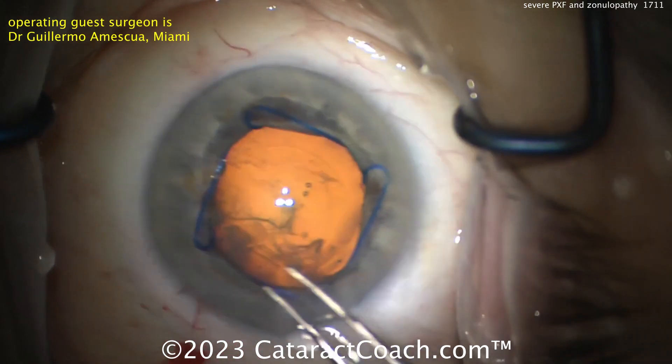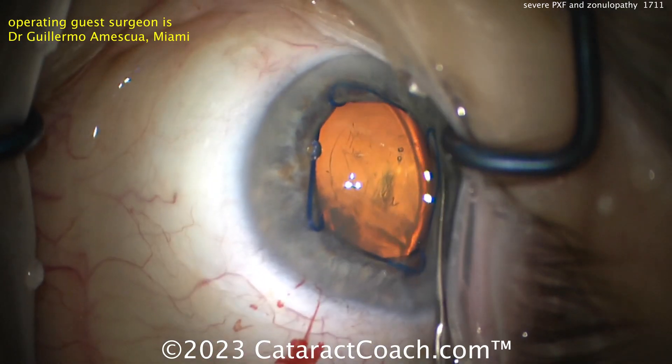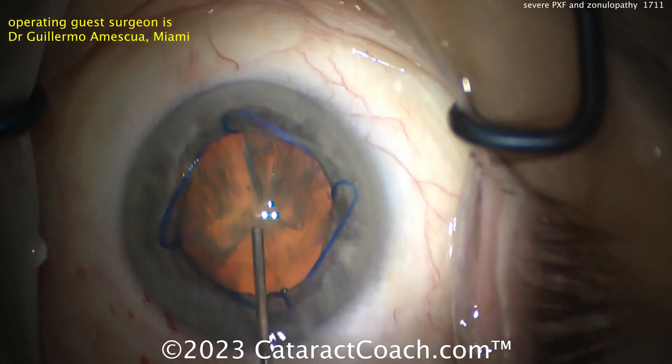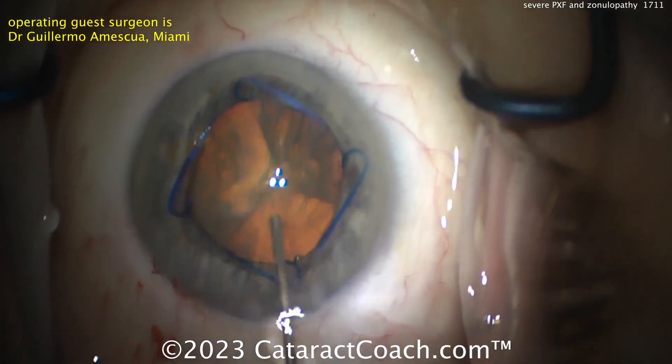Completing the rhexis here. Looks like perhaps a four-and-a-half to five millimeter rhexis — that looks pretty good. Now hydrodissection. Look, the whole nucleus has movement. This is a little unnerving.